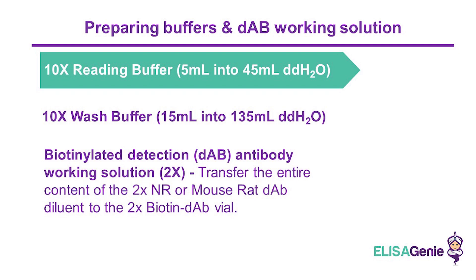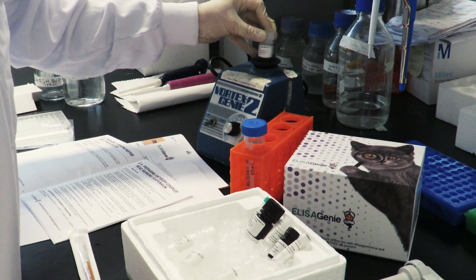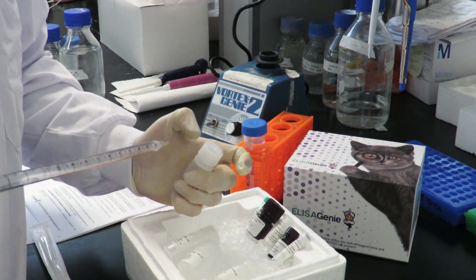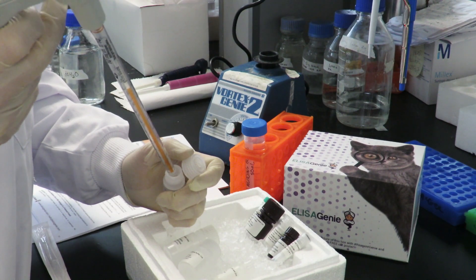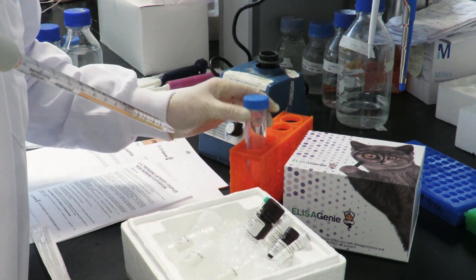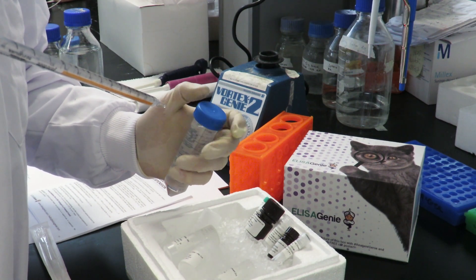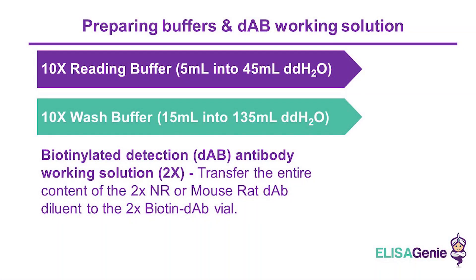Start by preparing buffer. Firstly, bring your read and wash buffer up to room temperature. Vortex your reading buffer for 15 seconds. Then make your reading buffer up to 50 millilitres using DD-H2O. Next, make your wash buffer by vortexing and add DD-H2O.